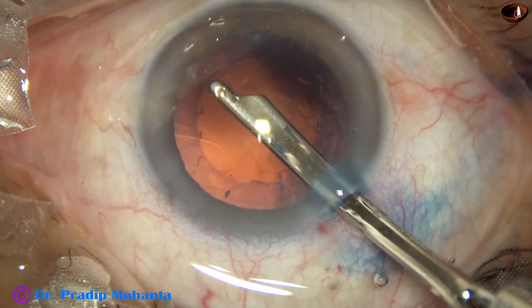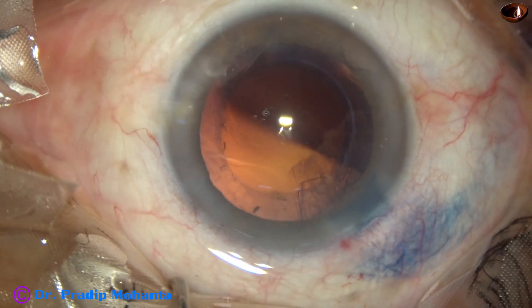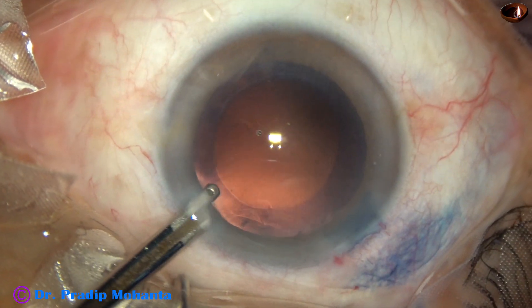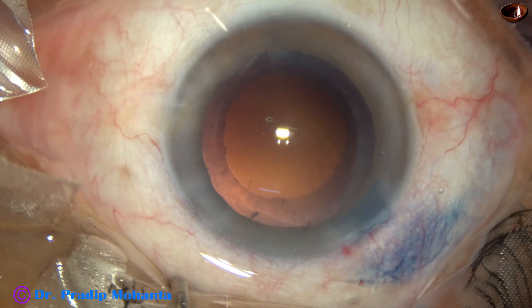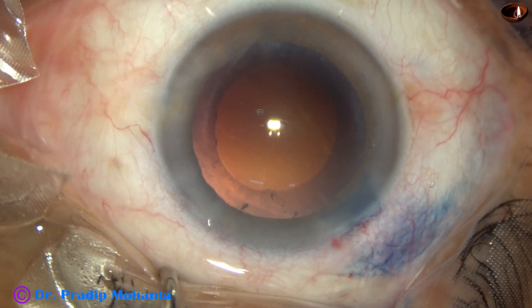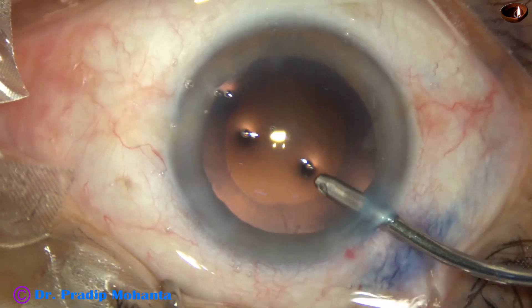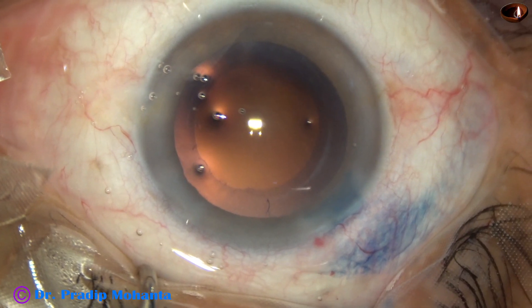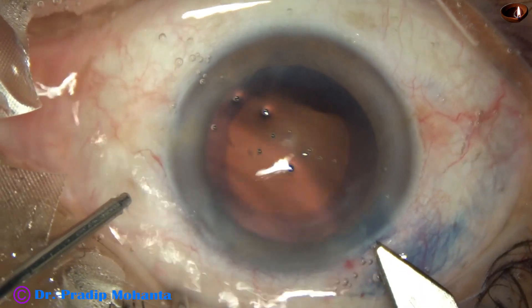This patient is a one-eyed lady. She has lost the other eye because of optic neuropathy. Now is the time to implant an intraocular lens. When the lens is a single-piece lens, we can easily do hydro-implantation of the lens.